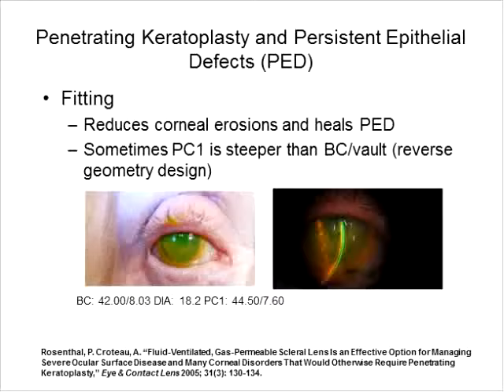Some patients have severe dry eye. A scleral lens holds a reservoir of fluid that is independent of the tears. This tear reservoir does not dehydrate over time and helps with severe ocular surface disease.